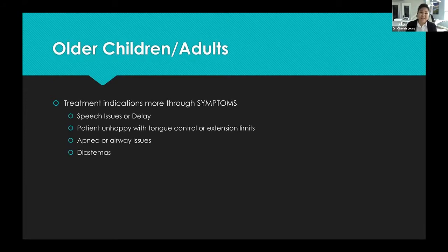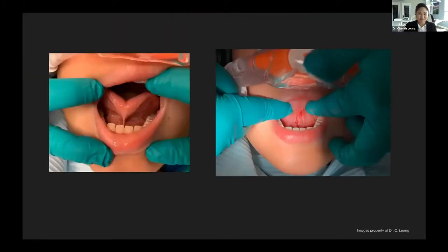And then, of course, for aesthetics, for diastemas, for ortho purposes, do they have that lip one? Do they have that tongue one causing a diastema between the lower ones? Do you need to treat that at that time? Is it going to make a difference for you? And those are all reasons to think about. Also, in consultation with your orthodontist, if they're like, do it, then it's a good indication.